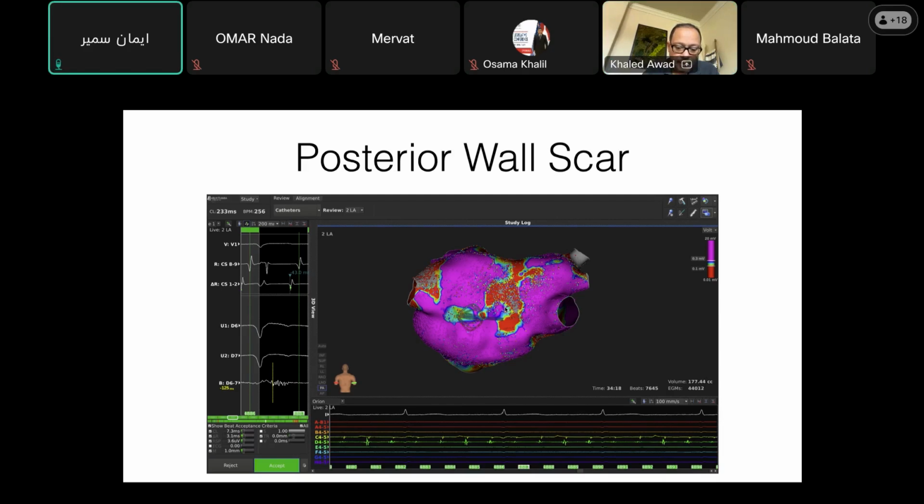So the concept is, if we do lines, we do bidirectional block after that. You have to. That's the concept. If you're going to be making lines, you have to block them. Yeah, here it is. I found the pictures actually. Let me see if I can show them to you.